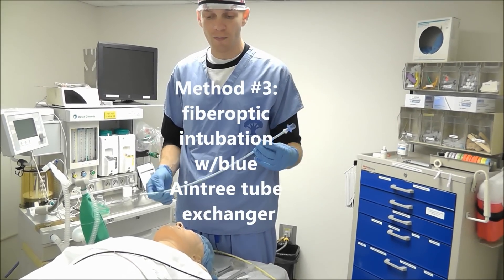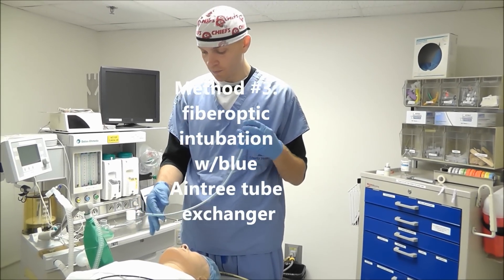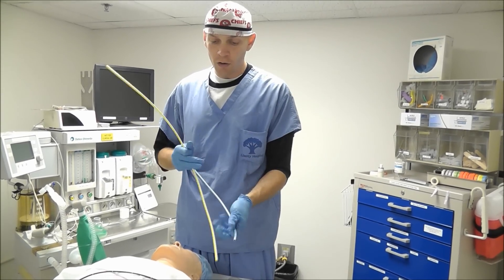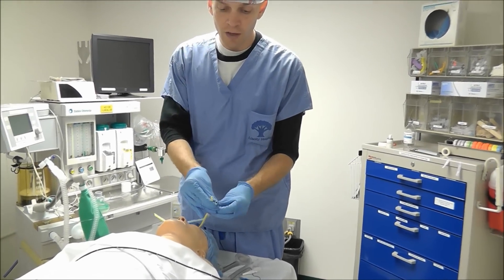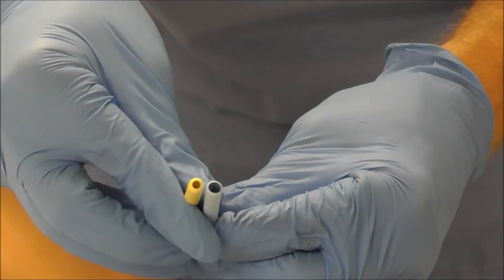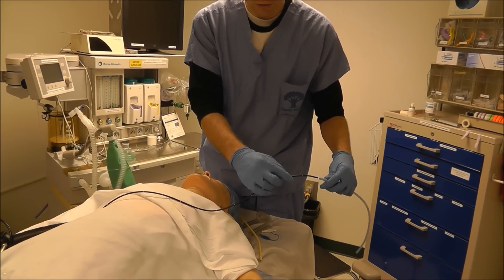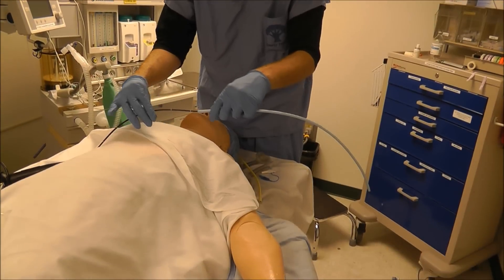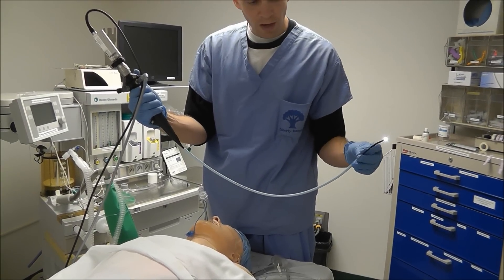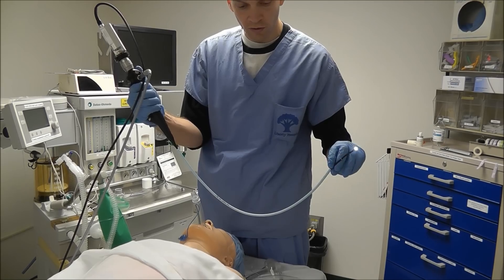The recommended method for intubating through an LMA is through use of a blue Aintree tube exchanger. This is just a regular tube exchanger like the yellow tube exchanger, but the lumen is much larger. The interior diameter of the blue tube exchanger is much larger than that of a yellow tube exchanger, so it allows us to slide a fiber optic bronchoscope through the Aintree tube exchanger. We get the Aintree tube exchanger over the scope.